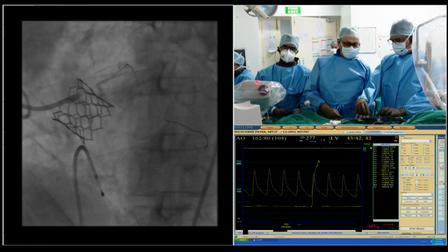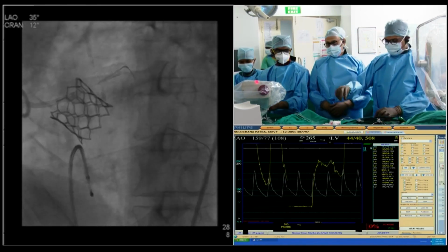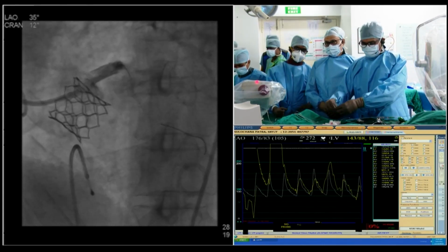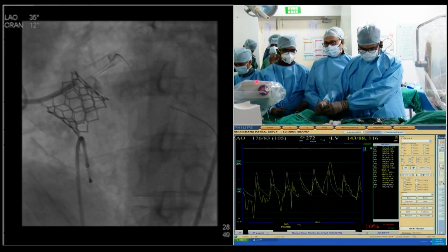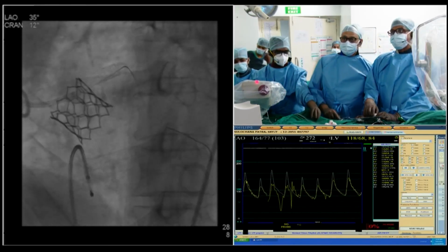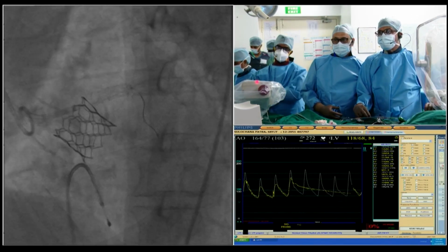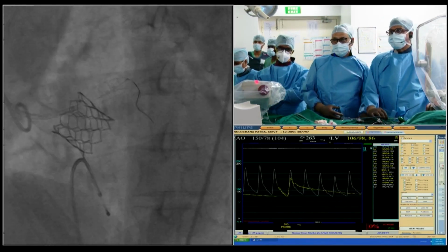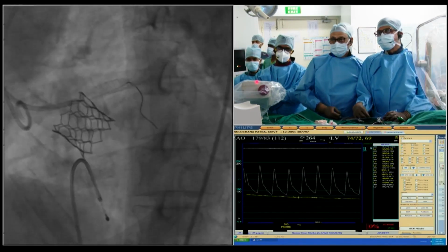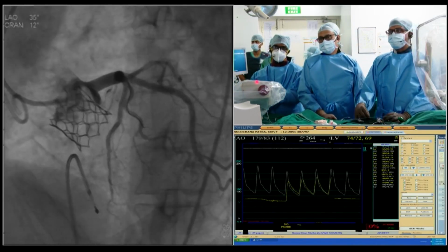You have to take out. Why are you having difficulty because of the balloon? So let's we'll take a better picture one time. No, and the big 5.0 balloon is sitting in the guide. Okay, Fluoro. All right. Okay, we'll take one picture in this view and one in caudal. Ready? Yeah. Okay. I think it looks the same. I don't know whether that's a caudal, please.